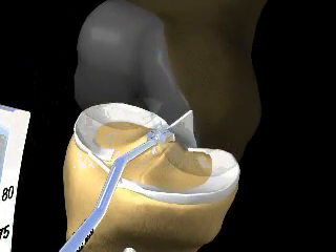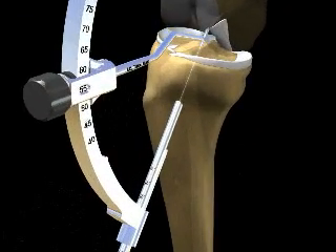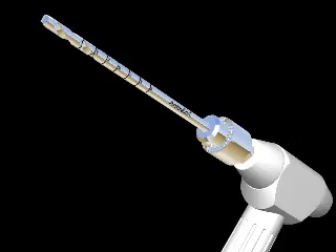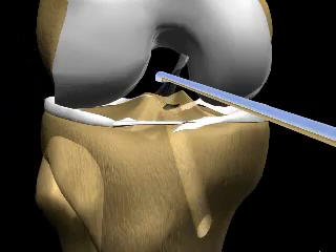The same incisions are used to insert a series of surgical tools to prepare for the placement of the new ACL. By creating a tunnel in the tibia bone and a socket in the femoral bone, the graft can be safely passed and positioned into the exact location.